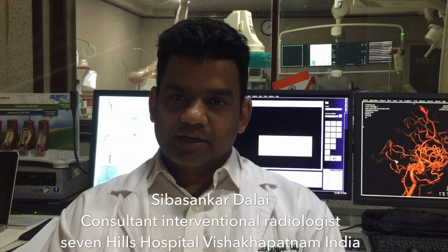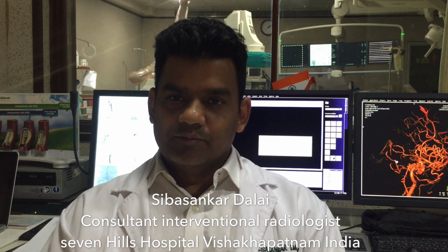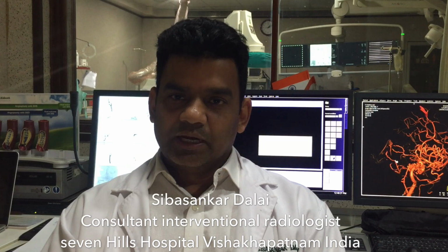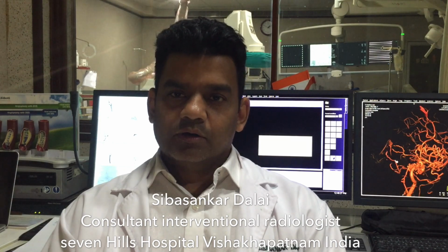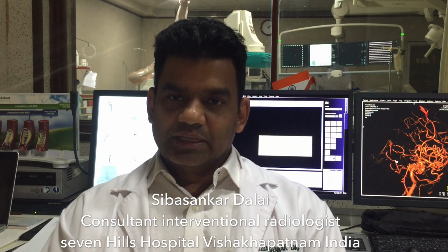So we are going to show you a case which has aorto bi-iliac occlusion, and the technique is called balloon in balloon angioplasty, which I have been doing. I devised this technique at Visakhapatnam, India, for chronic aorto bi-iliac occlusion. We are going to demonstrate that.